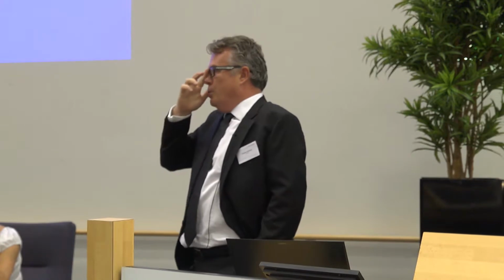What I try to say in this lecture is that the pressure you see when the plateau appears on the machine, if you look at tidal volume or the actual pressure, sometimes it's not so clear, sometimes it's very clear where that plateau is. What you do here is come to a point where the patient's down-regulation of drive goes so fast that he is simply saying, I don't want to have more.